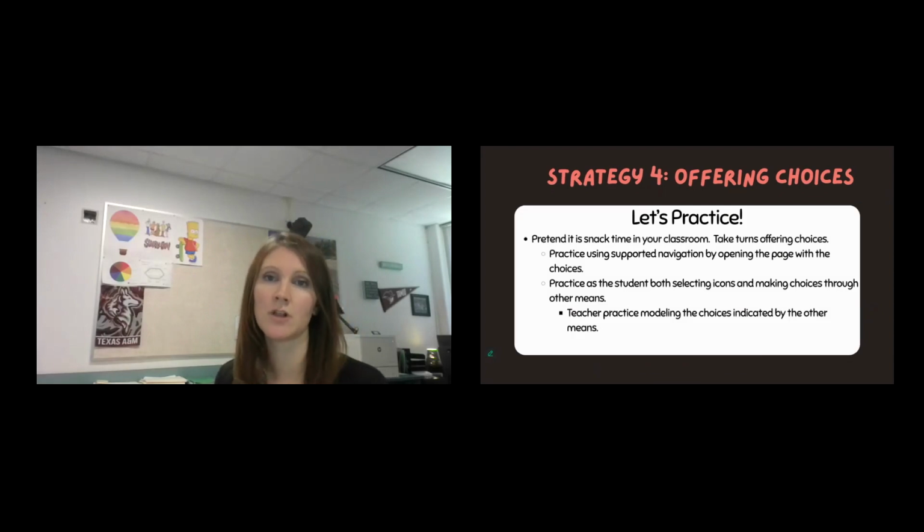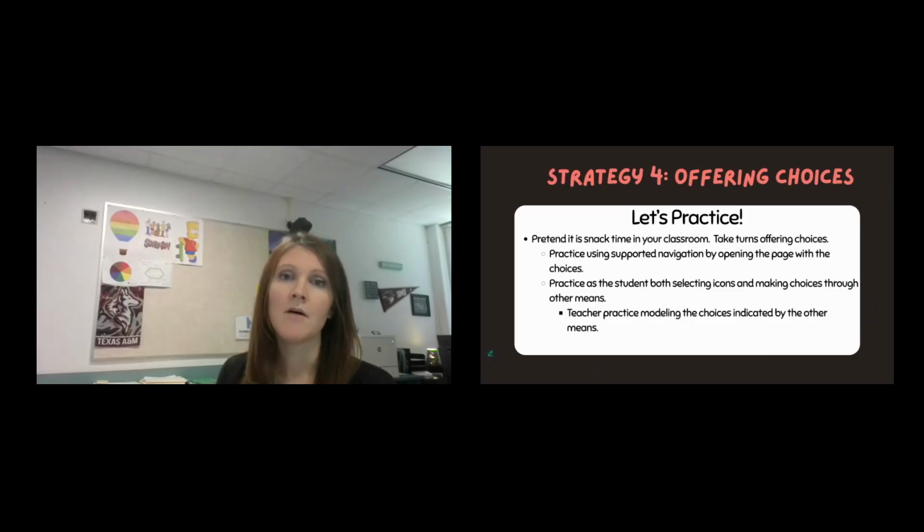Pretend that it's snack time in your classroom. And when we've done this live, we've done partners. You may be by yourself, but you can practice offering choices. So you might do something called supported navigation by opening the page that has the choices on it. So you might be opening the food page at snack time so that they can visually see that and maybe be cued by that. And you can practice just selecting icons or making choices through reaching.